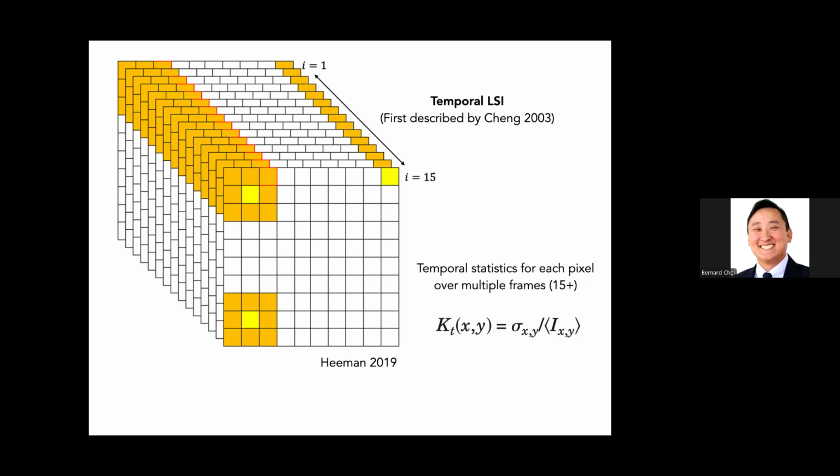How do you deal with the 0 point? We're not looking at velocity. We're looking at speed. With this sort of imaging, you cannot, unless you go at really high speeds and track speckle actually moving, which you can do. They do that for biomechanics work. In general, you don't have any directionality to this. It's just basically a metric of flow, but it's not telling you which direction it's going in.